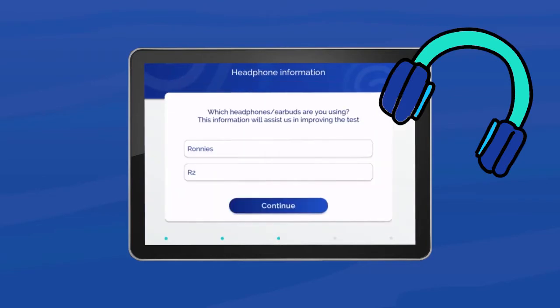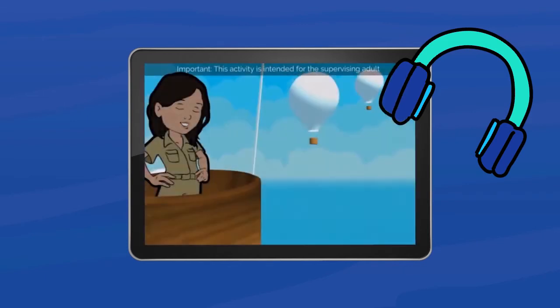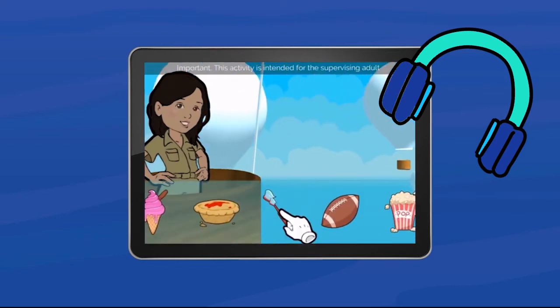Complete the Supervisor Test yourself. Or, if you have a known hearing issue, it's better to ask another adult with good hearing to do it. The Supervisor Test is designed to set the levels for the test and takes only a minute or two to complete. Once you've finished, do not adjust the volume.